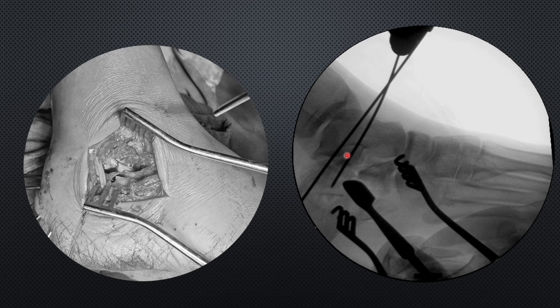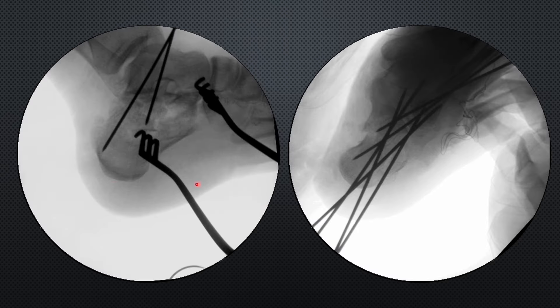Once that is done, you can check under the C-arm whether the articular reduction has been maintained. Now you see the whole posterior facet is aligned with the undersurface of the talus — this is the medial fragment and this is the lateral fragment, and the reduction has been restored. This segment is the anterior process which was comminuted. You should provisionally fix these fragments with a few k-wires, and then multiple k-wires can be passed from the tuberosity through these fragments to secure the articular reduction further. After that you need to check the axial view, and only then fix the tuberosity with multiple k-wires towards the medial and lateral facets.